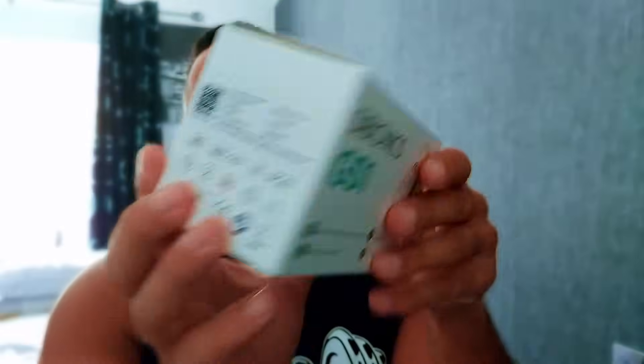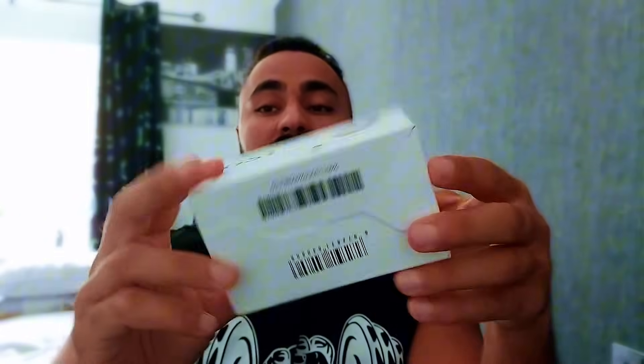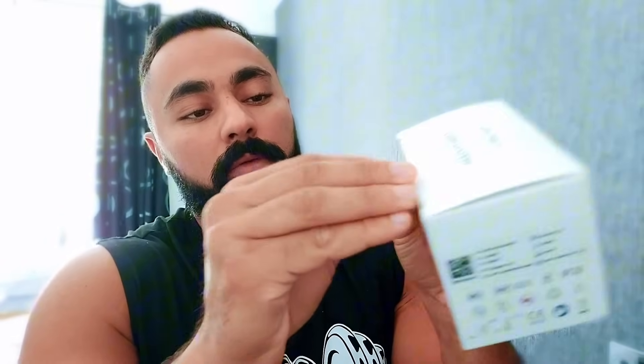So this is how the box looks. It is tiny — I mean, this is it. I can hide it in my hands; it's not massive. I'm just going to take that sticker off so we can open the box.